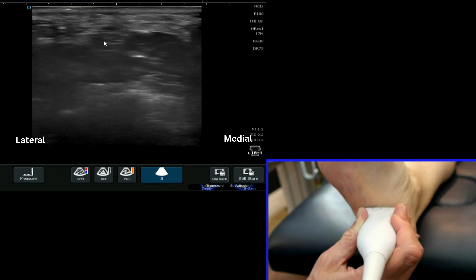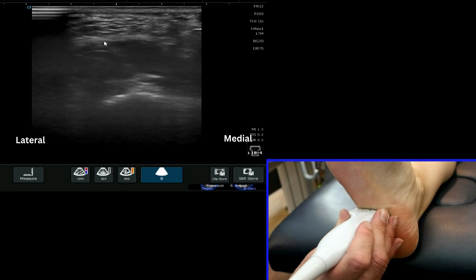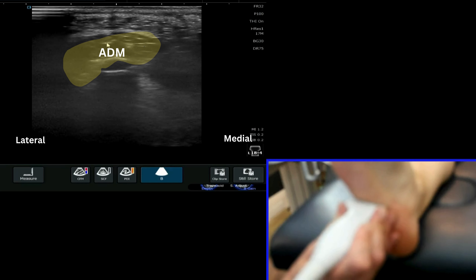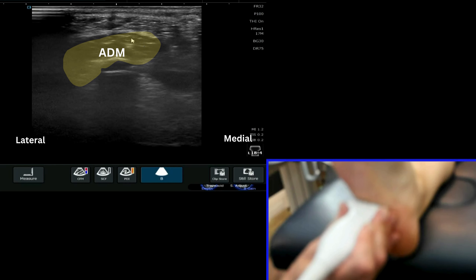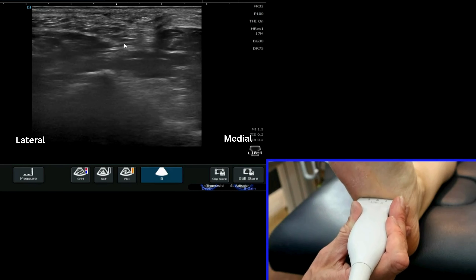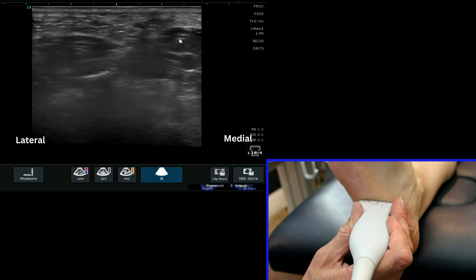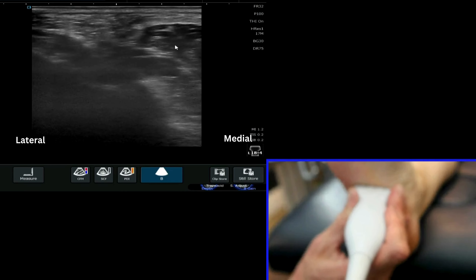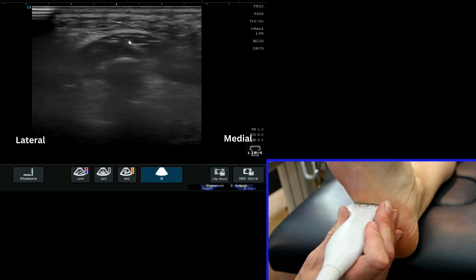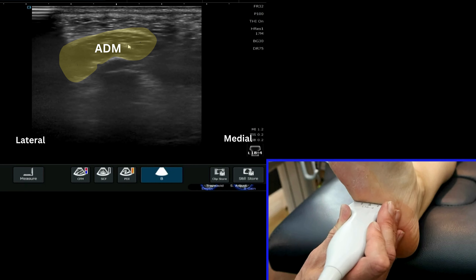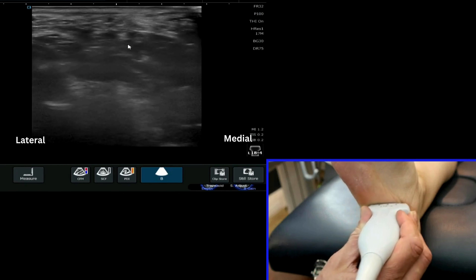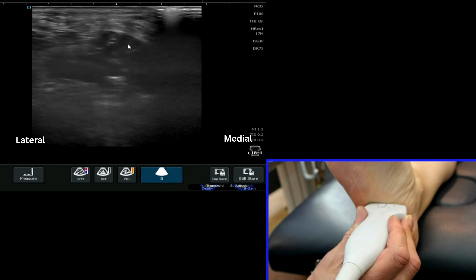Rolling the probe more laterally, we start to come across the muscle of abductor digiti minimi. You can usually get a view where you have the plantar fascia here, flexor digitorum brevis, and then the abductor digiti minimi creating that lateral border on the side of the foot. You can see the position relative to the probe, which is more central to the plantar fascia.